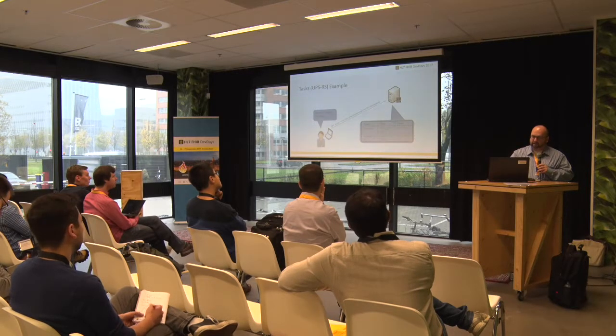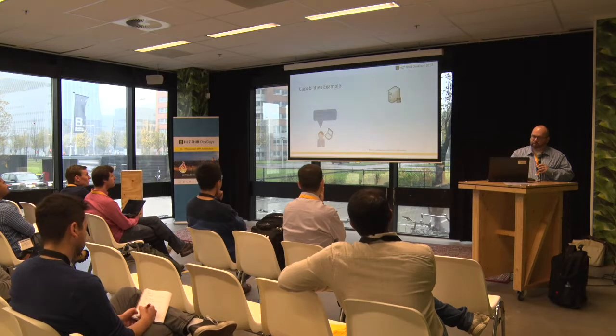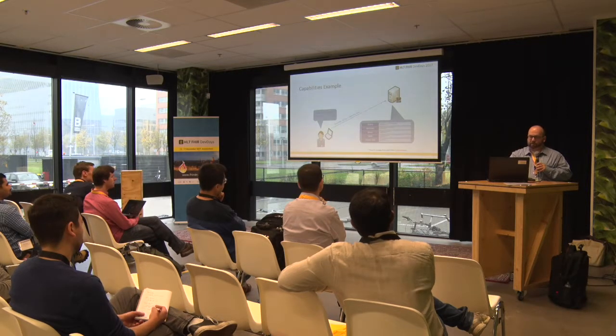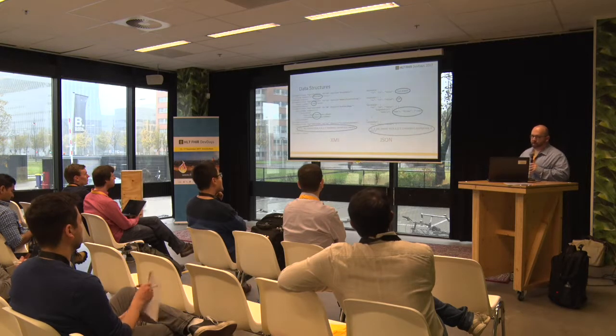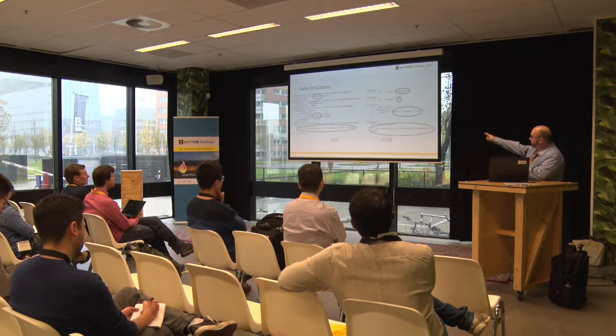I get back a list of studies and away I go. And if I want, similar to the capability service that FHIR has, we can say, give me, using the options verb, and it gets back a list of services that the server supports. Yeah, there's synergy with the performance there. We use both XML and JSON data structures, your choice. You can see the synergy between the two different objects.